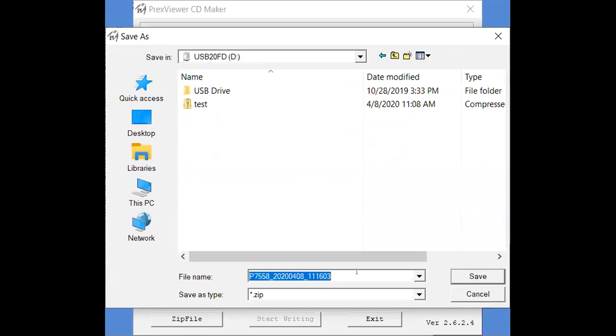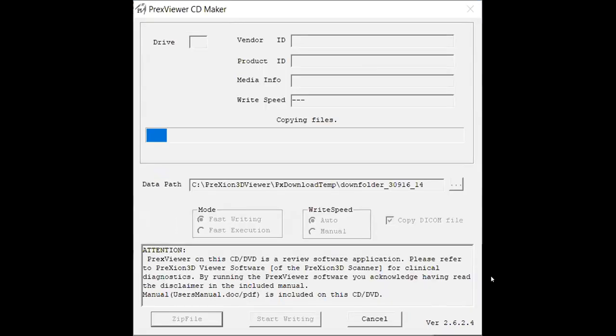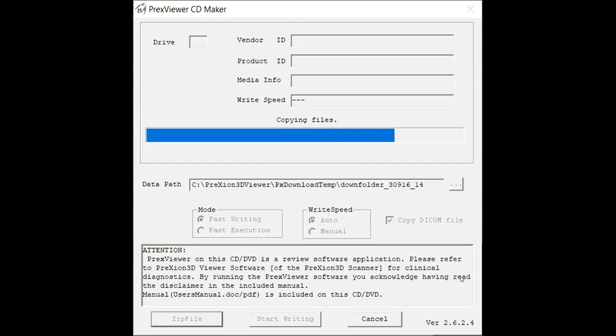It does give you the option to change the file name but if you do so please be mindful of HIPAA compliance. Once the file name is changed you can go ahead and select save and it will again show you that progress bar of those files being copied over onto the USB.